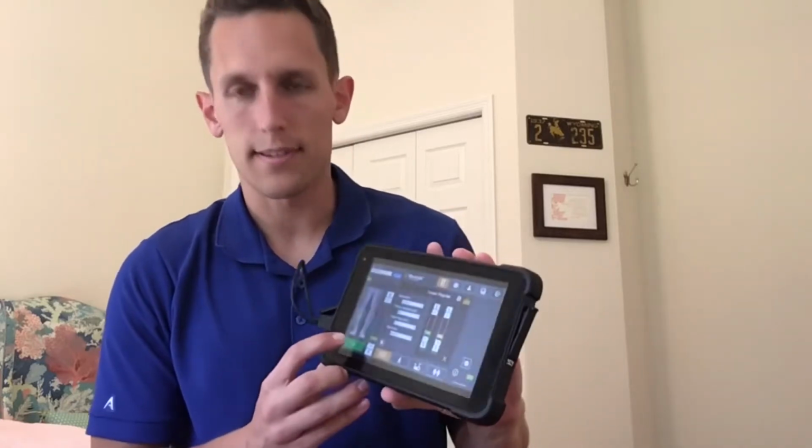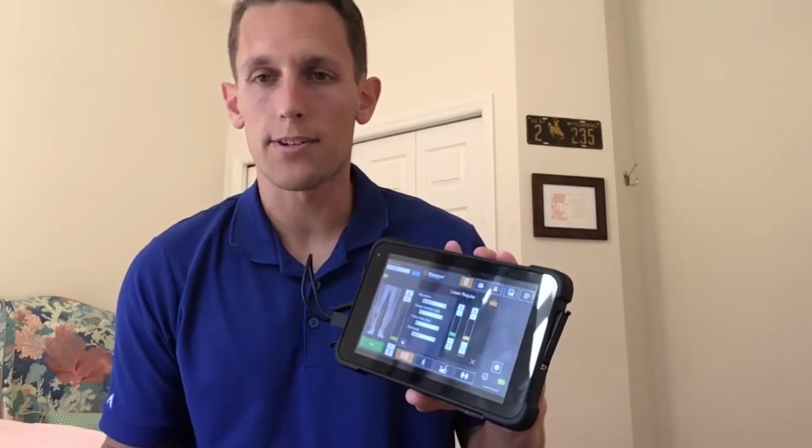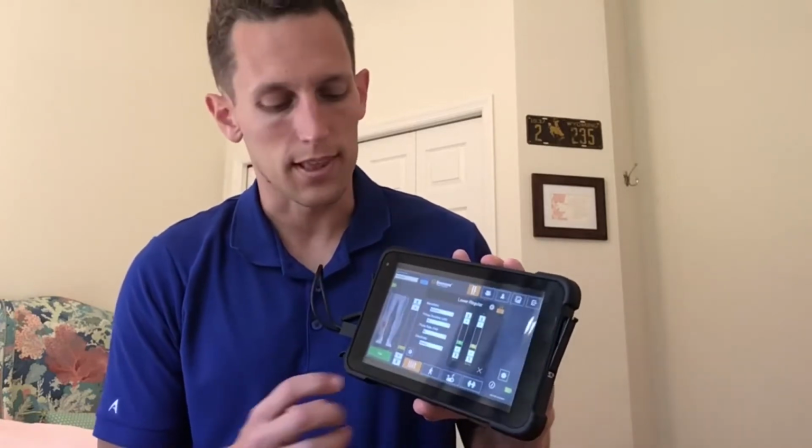I wanted y'all to have a quick video resource for any common errors that are happening with the L300 Go, as well as errors with the tablet. So first off, one of the main errors that people get first is they'll go to turn the system on, they hit the test button, and they start getting an error sound, as well as a red light.